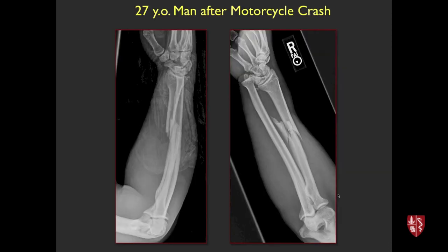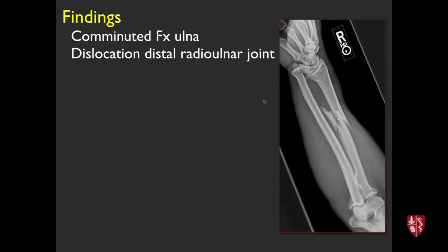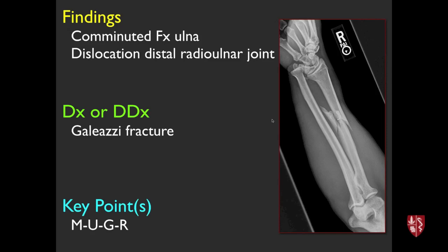27-year-old man after a motorcycle crash. There's a fractured radius along with dislocation of the distal radioulnar joint. This is a Galeazzi fracture. Using the mnemonic: Monteggia goes with the ulna, Galeazzi with the radius. Remember the ring concept — a fracture with an associated dislocation.